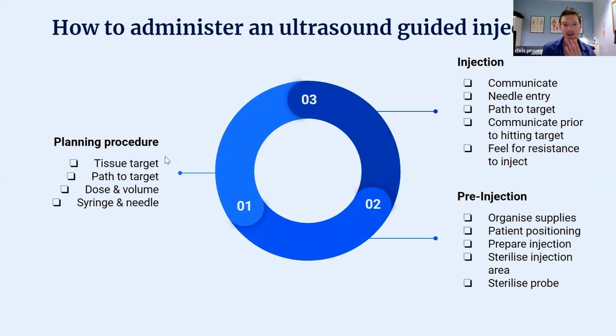I want to get the needle tip in, and you need to measure how deep it is and how far away from the entry point. Because if you pop a shorter needle in, you're not going to get to it. I won't mention names, but I was asked about this yesterday by someone who popped a short needle in and didn't get to the tissue target, and you need to then abort and do it again. So it's not exactly good for the patient.